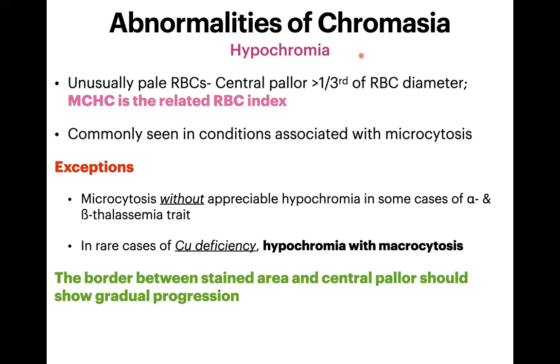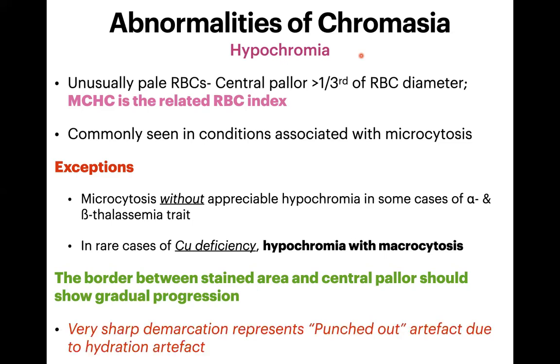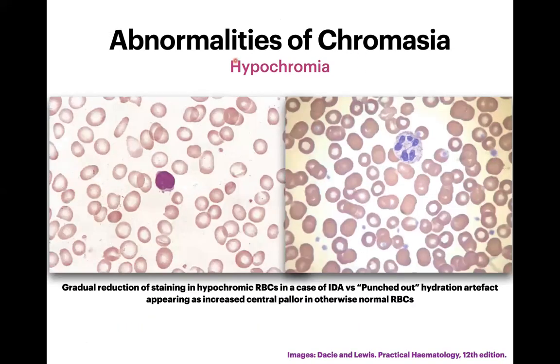Regarding the hydration artifact discussed last time: the border between the stained area and central pallor should show gradual progression — lightly stained centrally, becoming progressively darker toward the periphery. This is very different from the punched-out appearance of the hydration artifact, which shows very sharply demarcated areas of hypochromia with abrupt transitions.